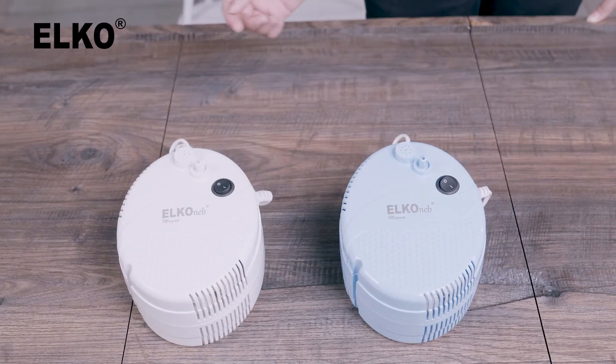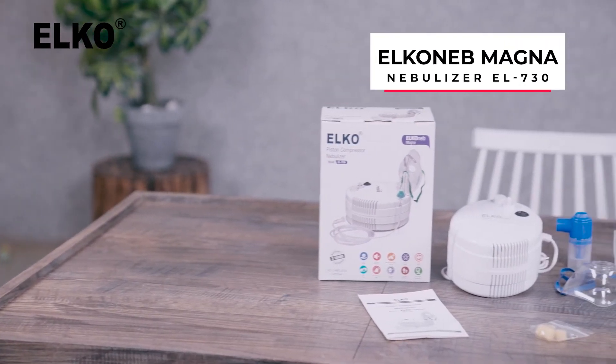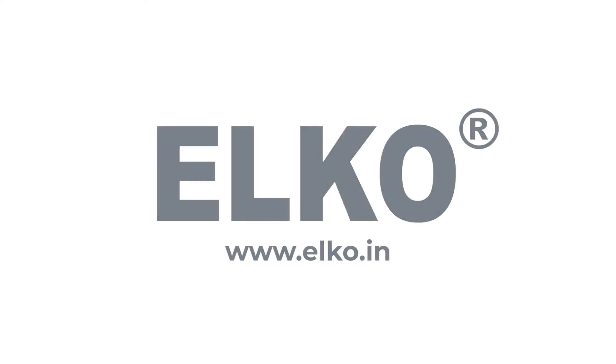This device comes in two color options: white and blue. The ELKOneb Magna Nebulizer by ELKO — an efficient way to take nebulization therapy. For more information about our products, visit our website at www.elko.in.